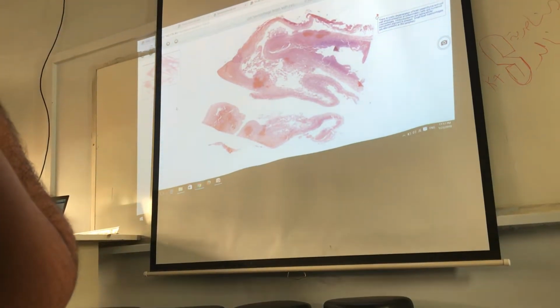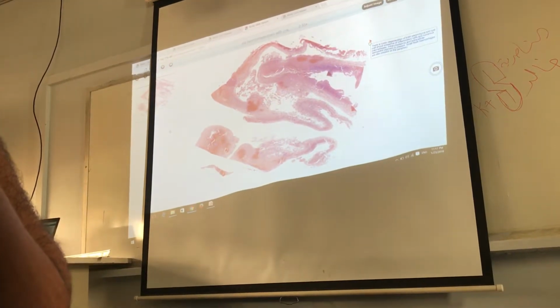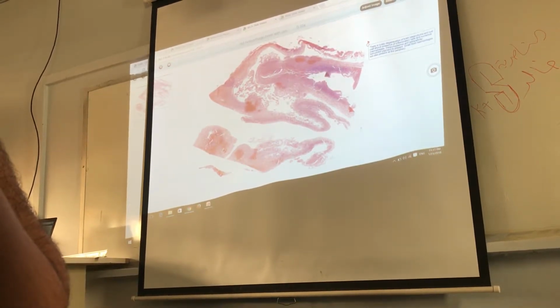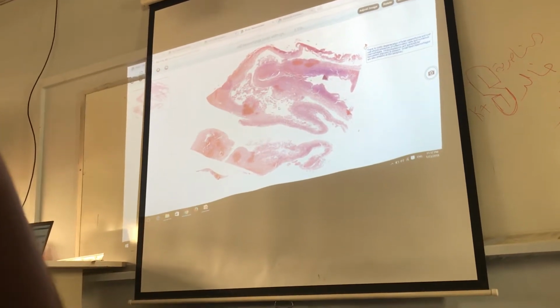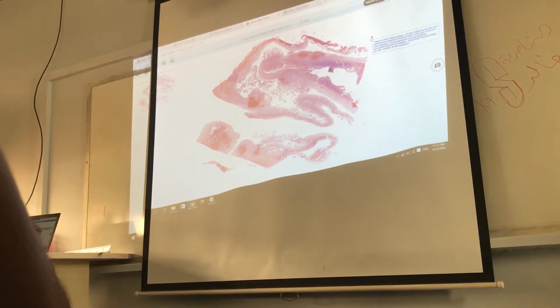What is this? What are you saying here? This should be completely filled like this, okay? The substance we are seeing here should be similar here. Yes, but there is loss of neuronal substance. Right. Why? Ischemia, infarction. Okay.